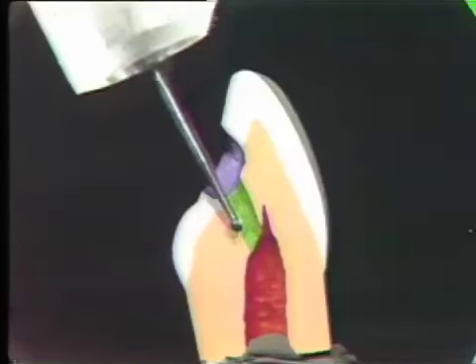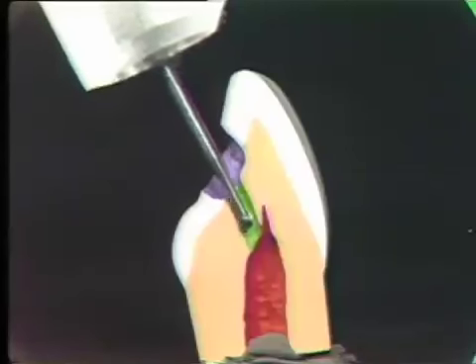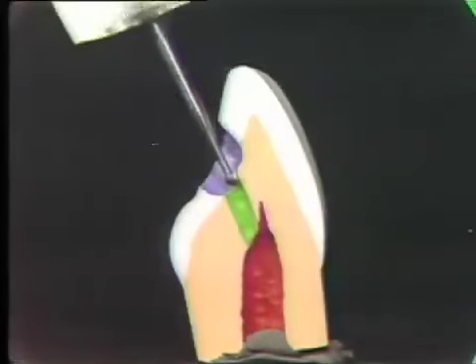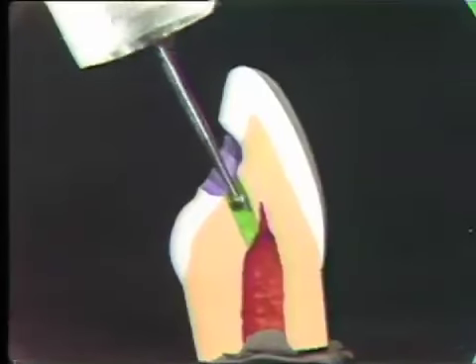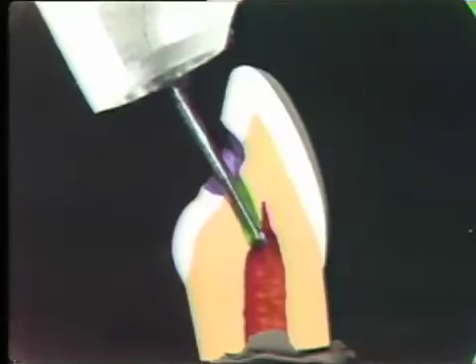If you really get lost and you feel like you just don't know where the pulp is or what the angulation of the tooth is, you may want to stop and take a radiograph. Here, you can see that someone has gone the wrong direction twice. He didn't realize the angulation, the long axis of the tooth, so he stopped, took a radiograph, and then he can reorient his burr to the long axis of the tooth and go directly on down. Once you feel the burr drop into the pulp chamber, stop the handpiece from running.